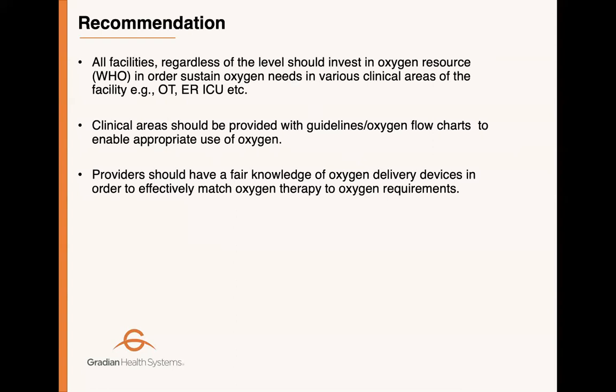But other monitoring should also not be forgotten, especially when you are in a resource-constrained place. There are patients who can be discharged even at home with oxygen. We've seen that after the pandemic. So sometimes you can just do the monitoring when the patient reports the changes, especially for the cases of chronic hypoxia. As I said earlier, it can be acute or chronic. But if you're in the hospital setting, assuming that it's acute hypoxia, we recommend that it should be continuous pulse oximetry.